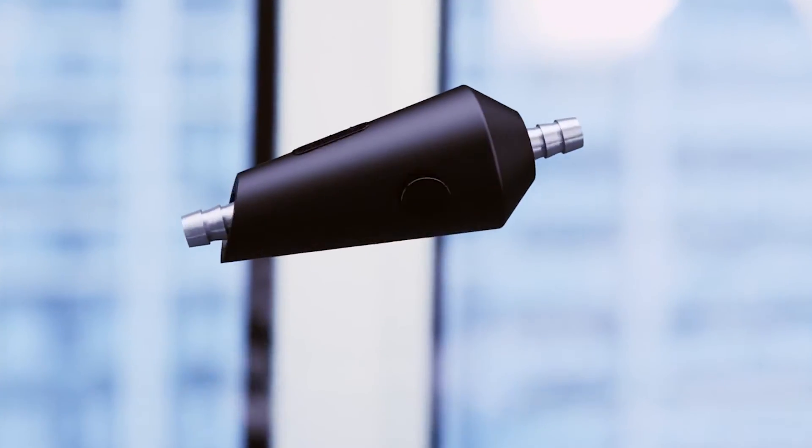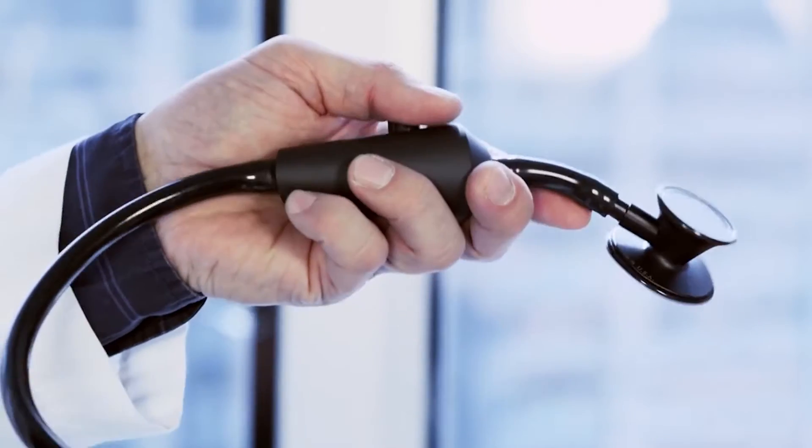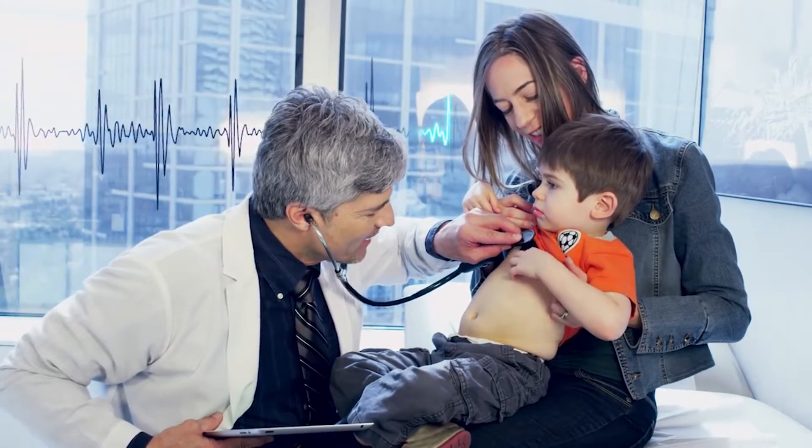Simply attach the device to your existing stethoscope and auscultate with unprecedented clarity. Core is the first digital stethoscope engineered to switch between analog and digital modes with the push of a button. Core helps you learn more from your patient's heart sounds than ever before.